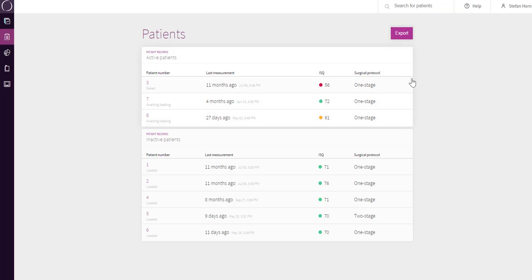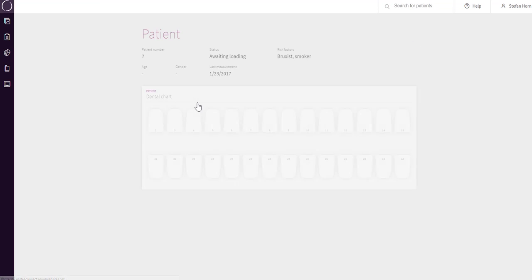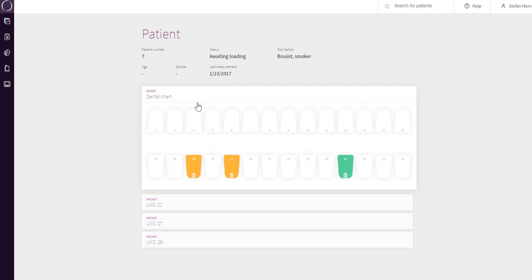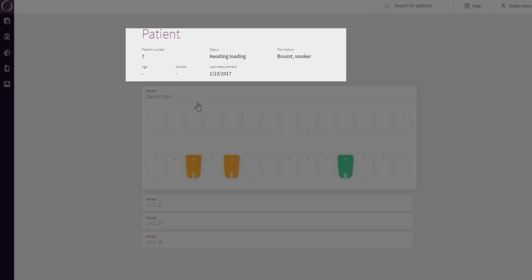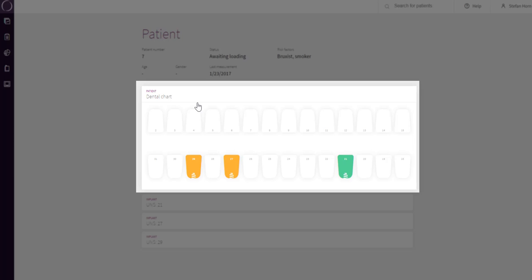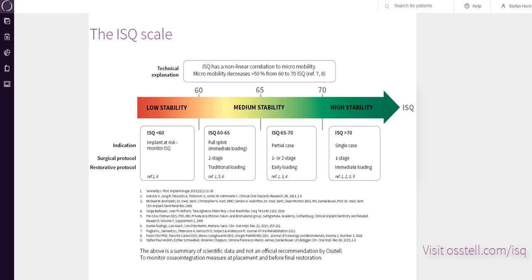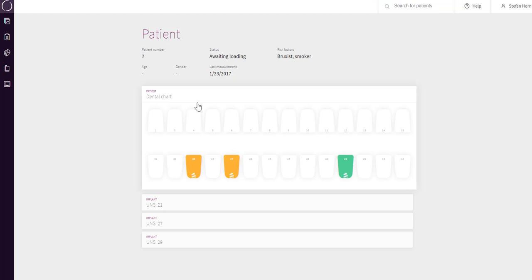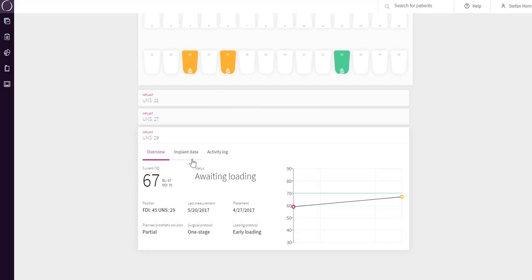If you select an active patient in the list, you will access a more detailed dental chart where you can see the status of all implants placed. In the top section, you will find general information about the patient and activity status. In the dental chart, you can see all placements made and each position is color-coded based on the ISQ level according to the published ISQ scale. To access further details on an implant position, just click on that tooth and additional information will appear below the dental chart.